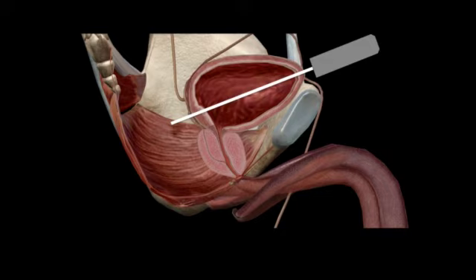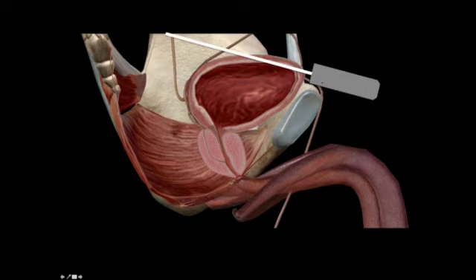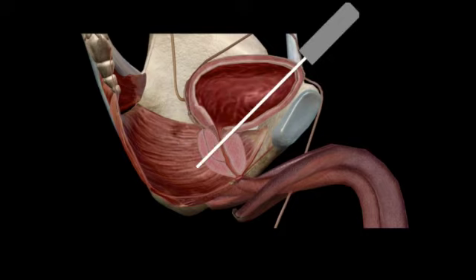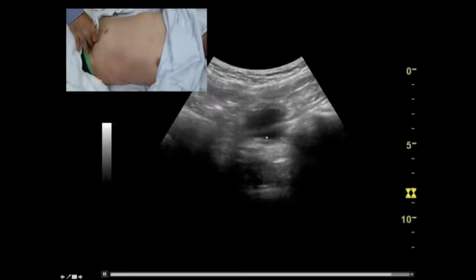When we're looking in transverse, which we always do next, we tend to need to fan the probe up. You can see I move, we're looking just above the symphysis pubis here, putting the probe right down there and fanning upwards, right through the bladder, and then fanning downwards. Now we're looking at the VUJs and where ureteric jets would occur, then right down to the prostate. So right through like that. Watch this here. You can see me fanning right down. Here, the seminal vesicles. Here's the prostate, and right at the bottom now.